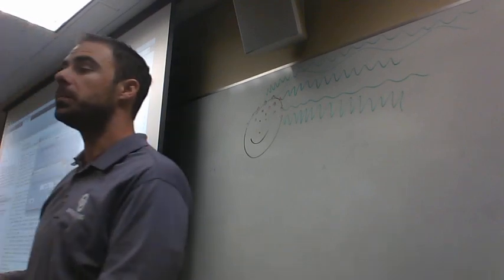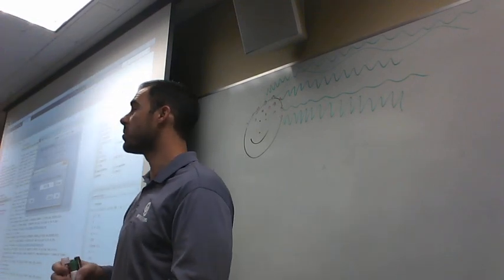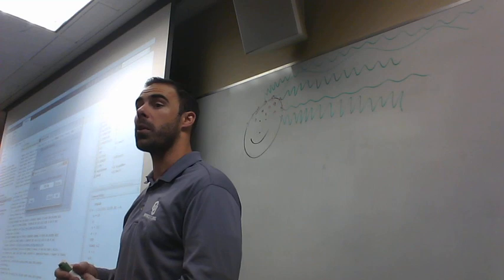So when I say some people use the nose or the earlobes or the vertex of the scalp, it can be research specific and field specific. We're going to use data that works with memory. In the memory field of EEG, people tend to use the mastoid sites. Therefore, we want our results to be as consistent as possible with what everybody else has so that we can compare them properly.